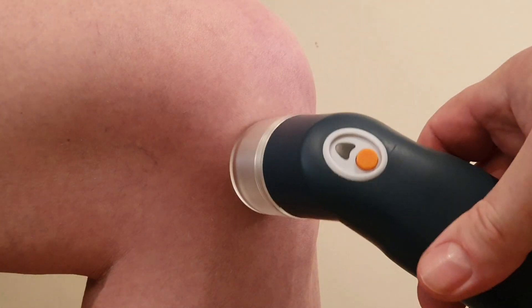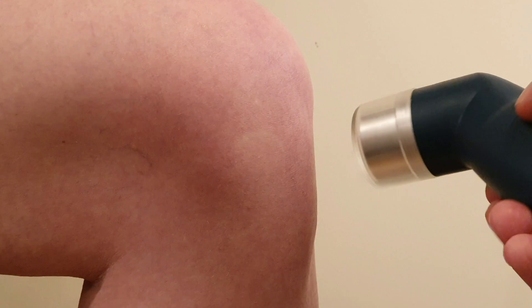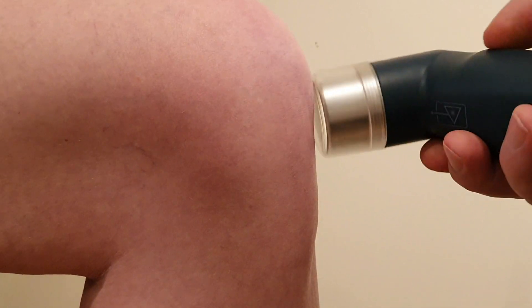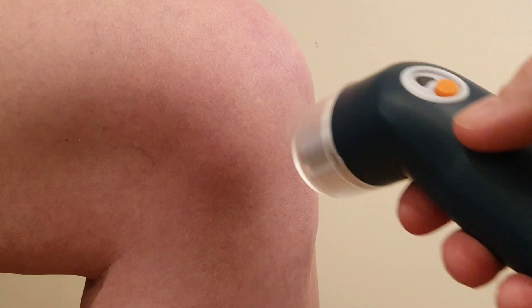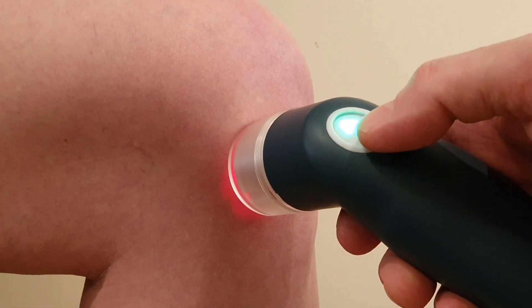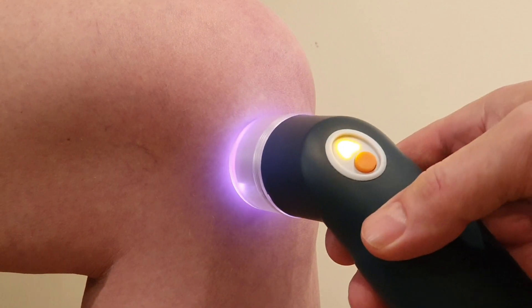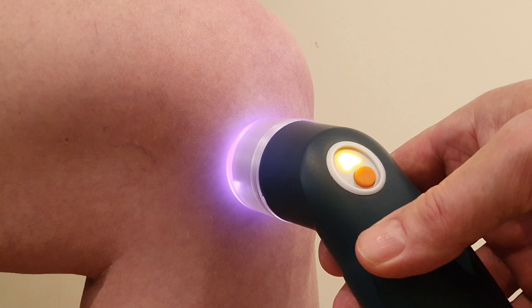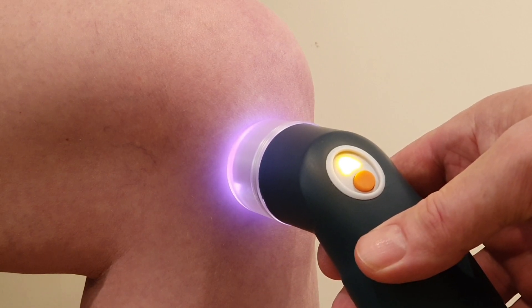From the patient's perspective, we're going to be doing two spots with the laser. We're going to do a spot on the joint line here, and then a spot further round on the joint line, sort of missing the patellar tendon. So we're going to start the laser and do our first spot.